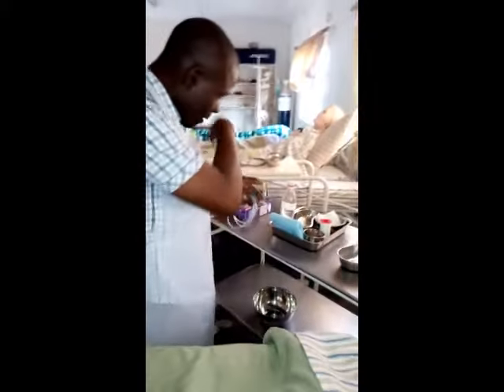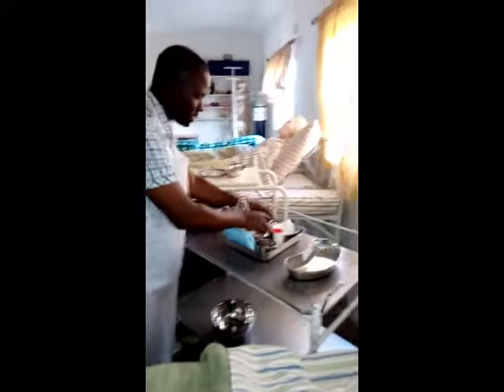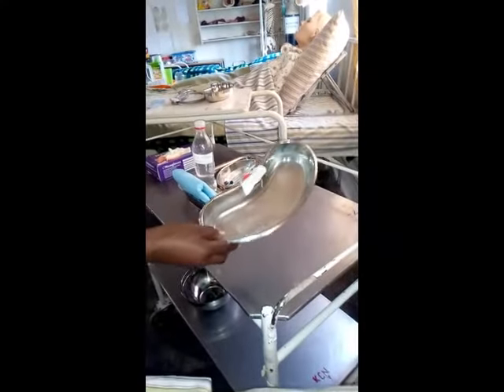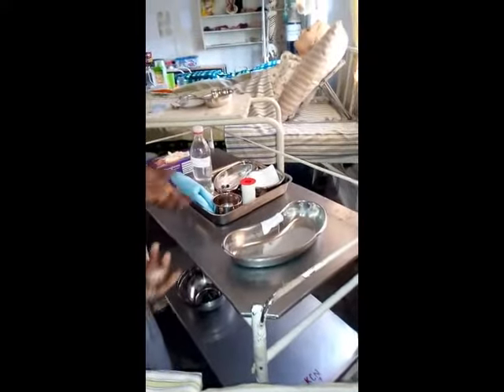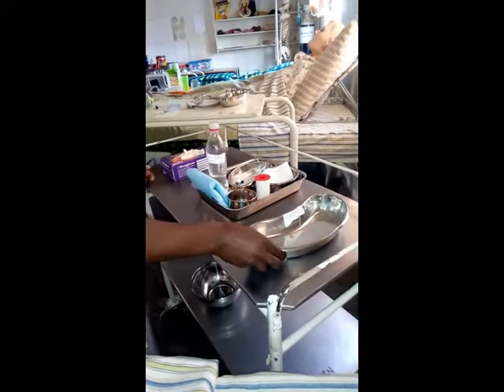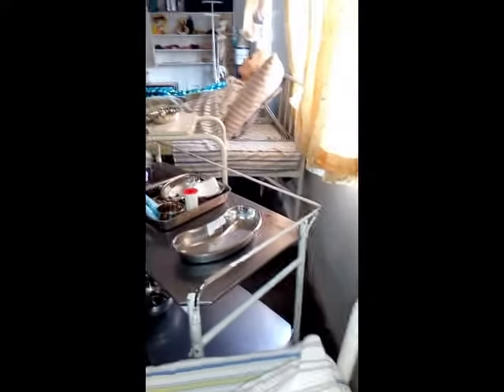Then let me introduce this trolley so that you understand it. On this trolley, we have this receiver. In this receiver, we're going to discard used items, for example used gloves or used swabs. So that's the use. Then we've got cool boiled water.